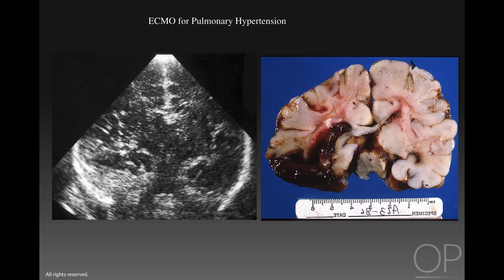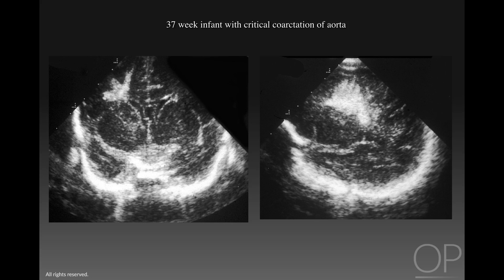In patients who have poorly clotted blood, the blood can range in echogenicity from the typical brightly echogenic to loosened blood, and often the blood will have an echogenicity similar to surrounding brain, making the extent of hemorrhage difficult to assess. This is particularly the case in infants treated with ECMO, where coagulopathy is quite common. In another child who is near-term with critical coarctation of the aorta, we see a flame-shaped hypertensive hemorrhage in the deep white matter.